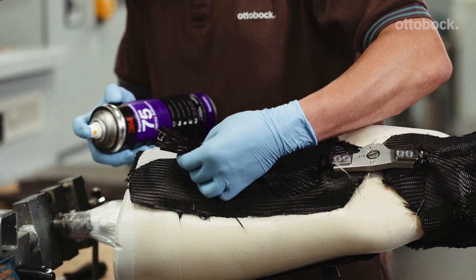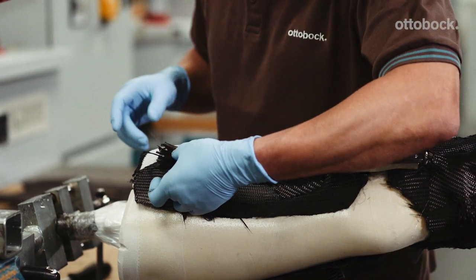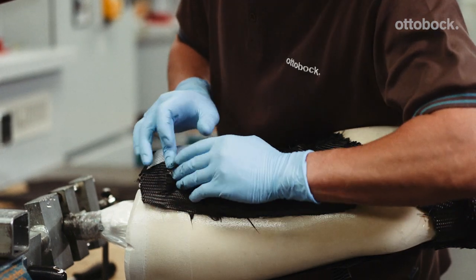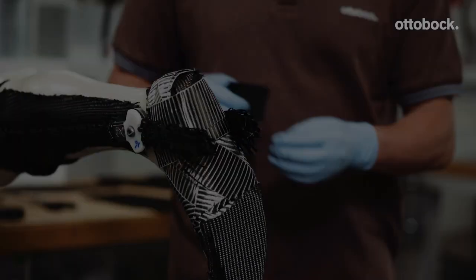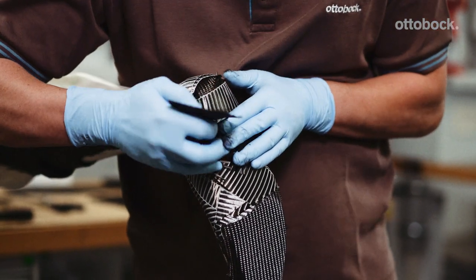Trim any excess UD carbon or stockinette on the thigh lamination bars as well. Trim any excess fabric on the foot stirrups, fan out the ends and fix in place with another leftover piece.